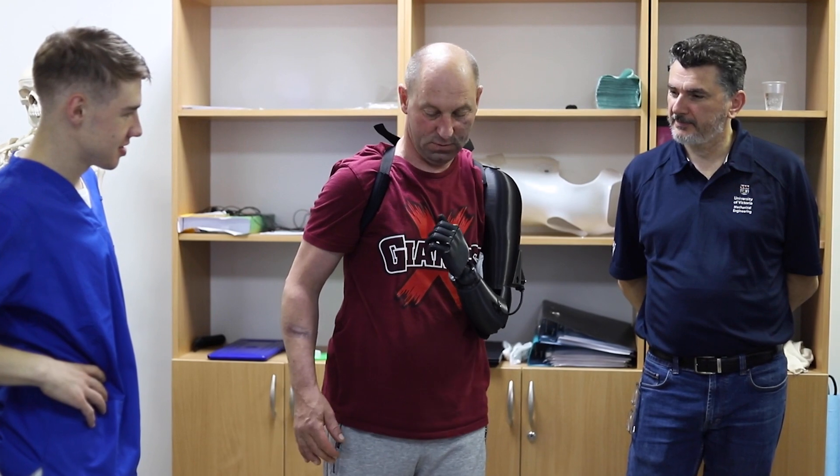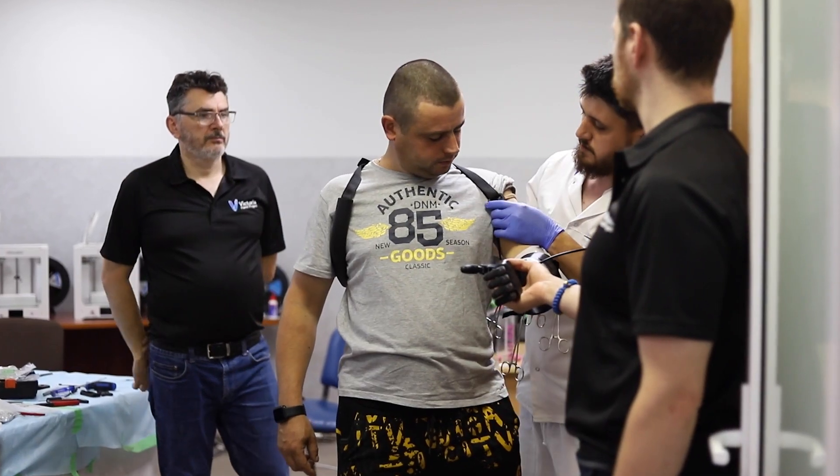We're very focused on upper extremity prosthetic care. We want to continue to improve these devices.